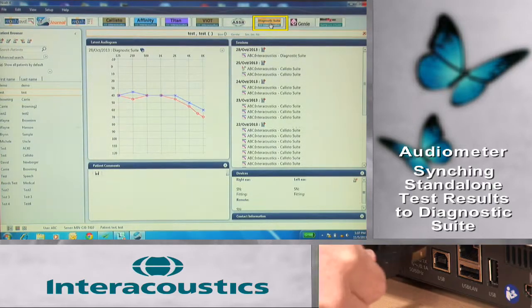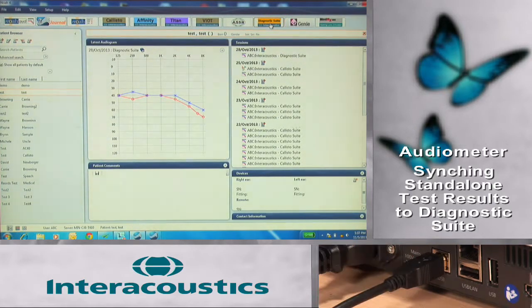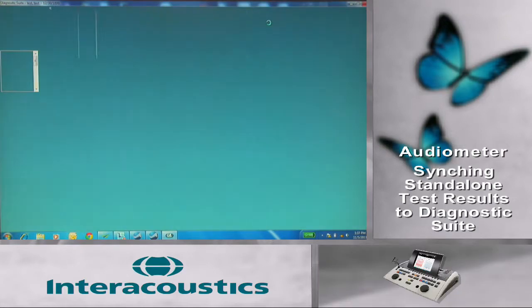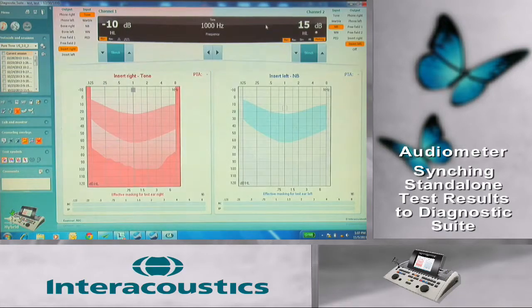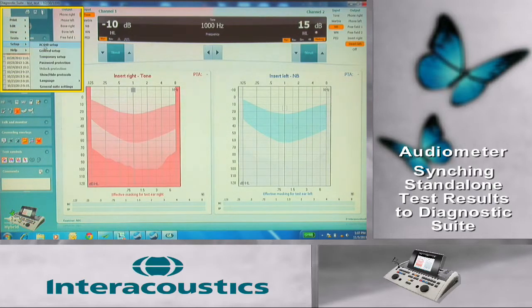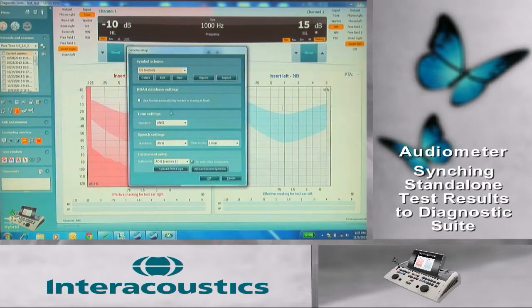Make sure the USB cable is connected to the audiometer and PC. Once within Diagnostic Suite, select Menu, Setup, General Settings, and uncheck the box located beside PC-controlled instrument.